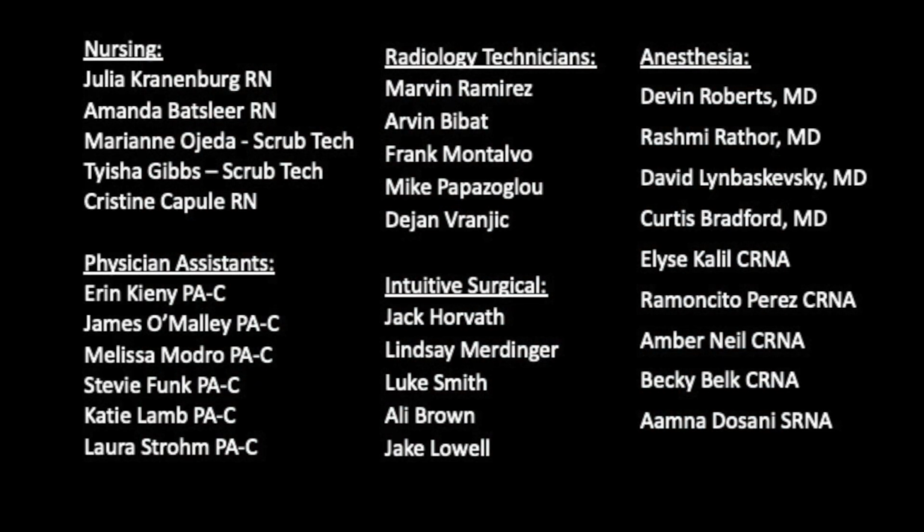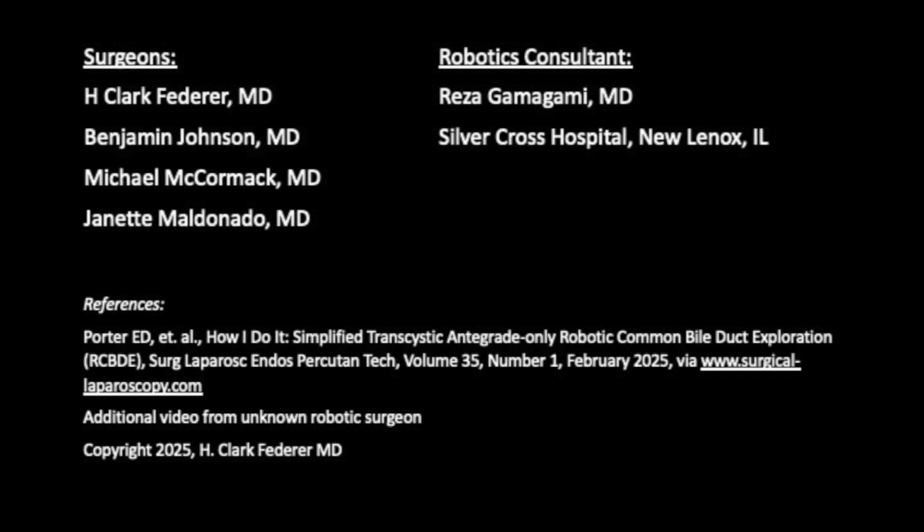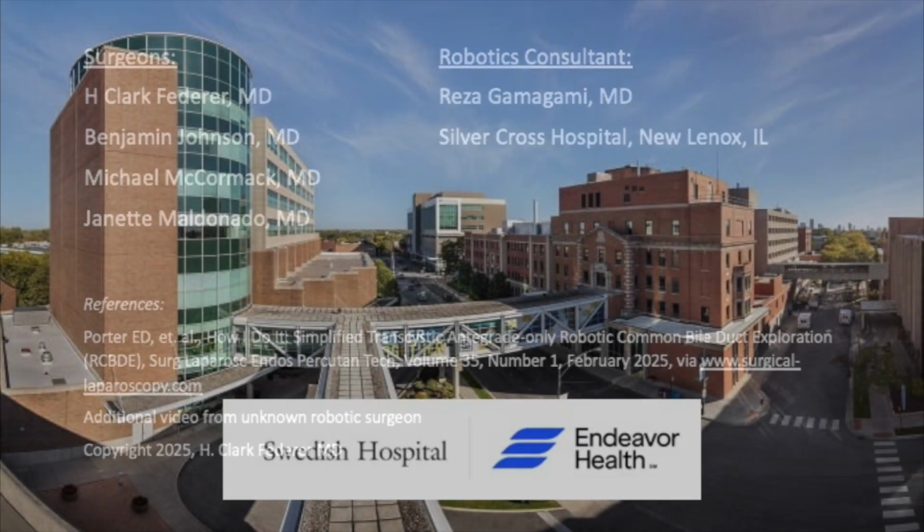This quality improvement project at Endeavor Swedish Hospital in Chicago, Illinois, was conducted with the input and support of many hospital team members, support from Intuitive Surgical, and robotic surgeons from other institutions.